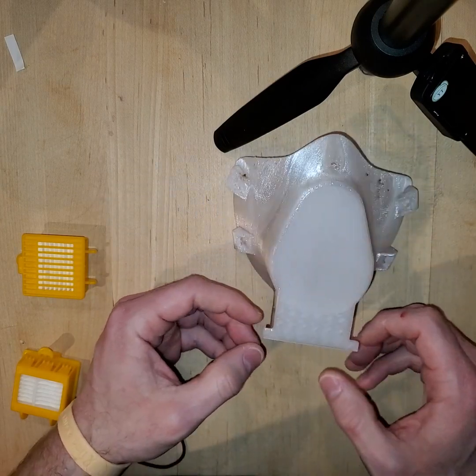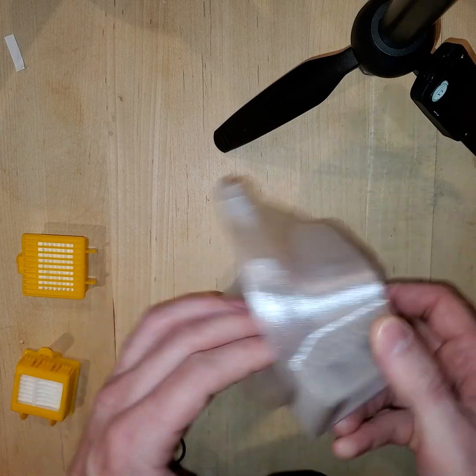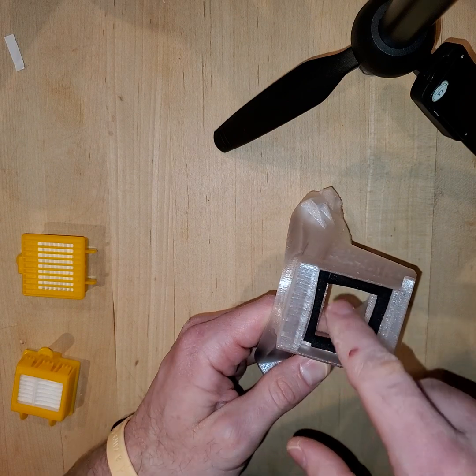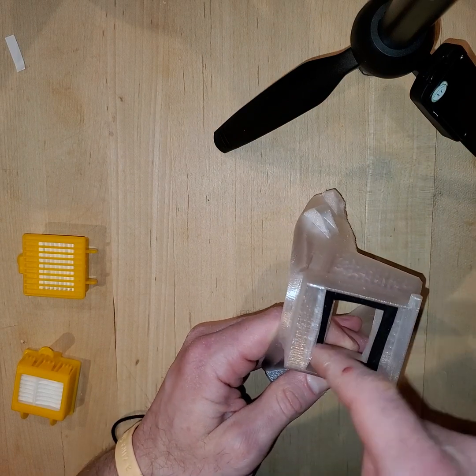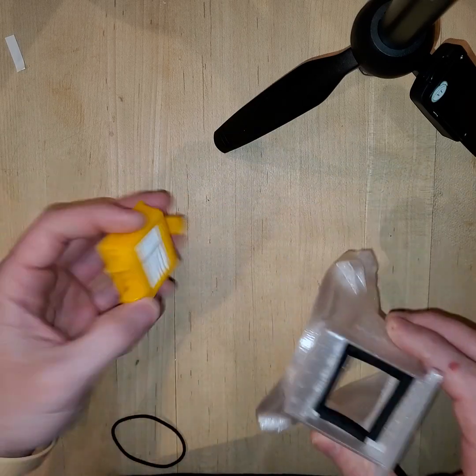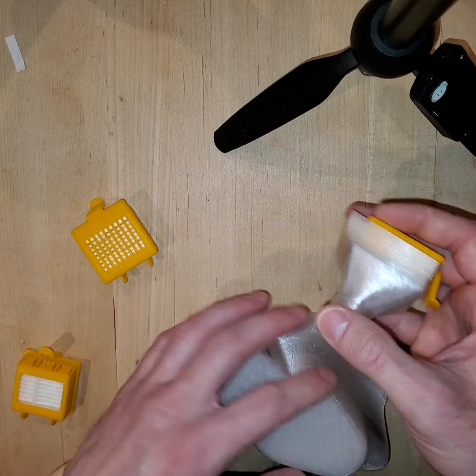Trying to keep this video somewhat short. I have another video that talks about how to apply this. It's just a 1/4 inch. I took a 1/2 by 1/16 inch foam tape and cut it down the middle, and you need about 2 inches of total foam tape per mask or per adapter.